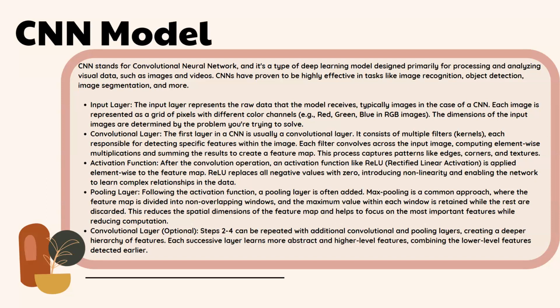The next layer is the convolution layer again. These extra convolution layers are generally optional, but we have them in our model, as we will see later. I have used two convolutional layers, repeating these steps: the convolution layer, activation function, and pooling layer.